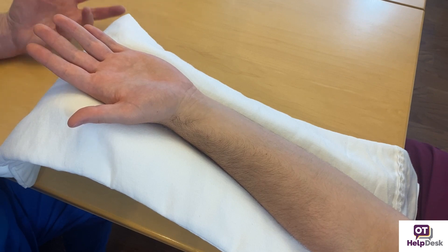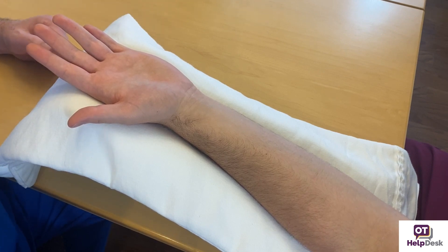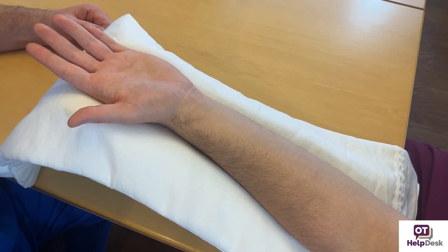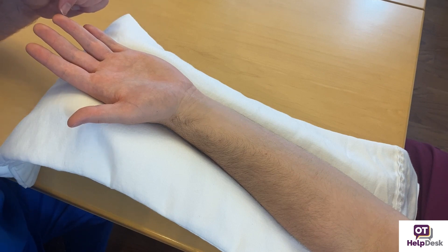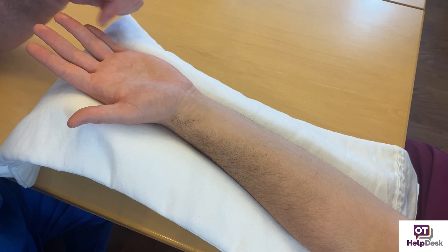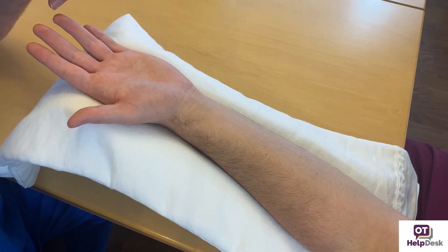This is something I do with clients because sometimes a digital nerve has been damaged — maybe they sliced it and the doctors repaired it — and that's how you test it to determine the level of sensation.